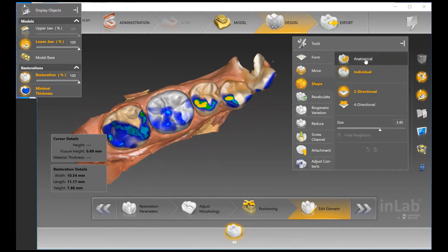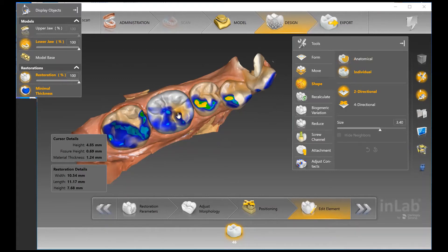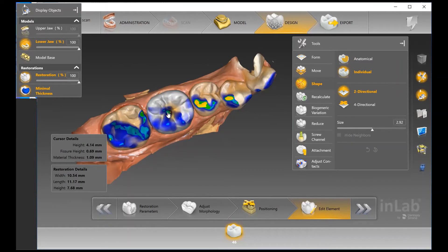With the Shape Tool turned on, you can use Anatomical mode, which allows you to pull surface areas — wherever your cursor hovers and highlights is the area you're manipulating. The other option is Individual, which lets you individualize the size of the tool so you can really zone in on one specific surface area.